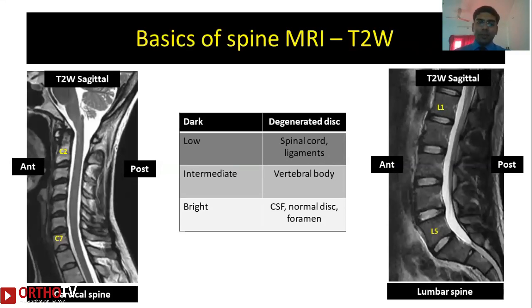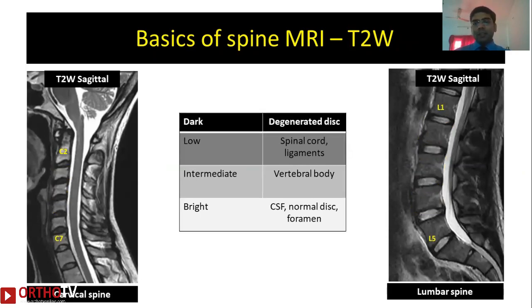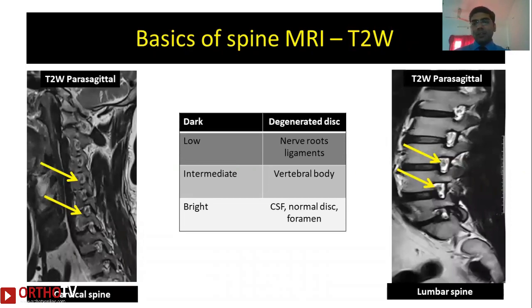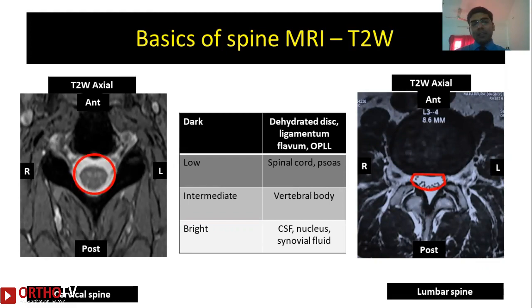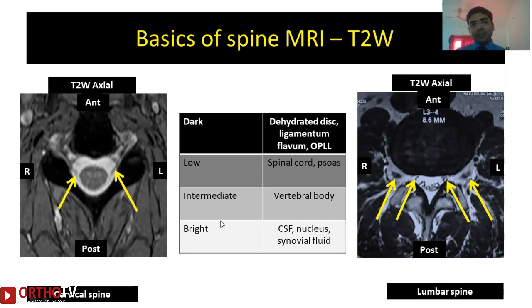On the T2-weighted sagittal image, apart from the bright CSF, you can see the intermediate intensity of the vertebral body; the discs appear bright when hydrated and become dark when they degenerate or are dehydrated. A T2-weighted parasagittal cut provides good information about foraminal structures. On a T2-weighted axial image you can see the dural sac and spinal cord in the cervical and thoracic spine, whereas nerve roots are seen in the lumbar spine. The structure anterior to the dural sac is the disc, and posterior to it are the facet joints. The traversing and exiting nerve roots at different spinal levels and any compression on them can be well visualized on the T2-weighted axial image.